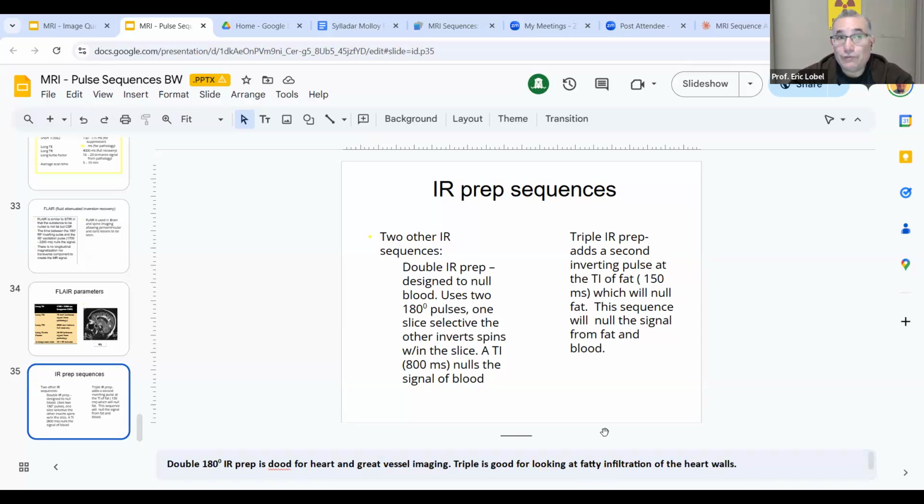There are other resources out there, questions and answers in MRI, but the most I think you'll get out of pulse sequences is clinical. Bring your little notebooks and your acronym sheet so you know which sequence you're actually studying, versus whatever the manufacturer calls it. And write down your TRs and TEs and what you see and what you don't see.